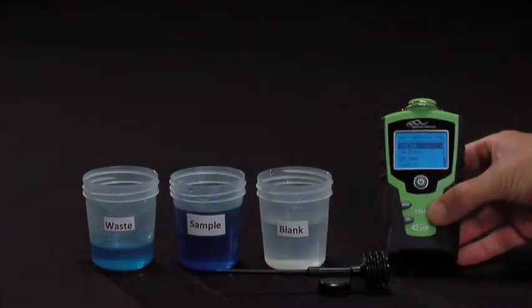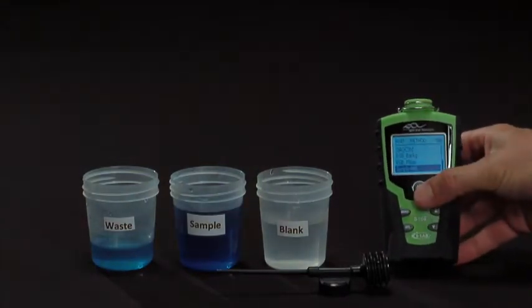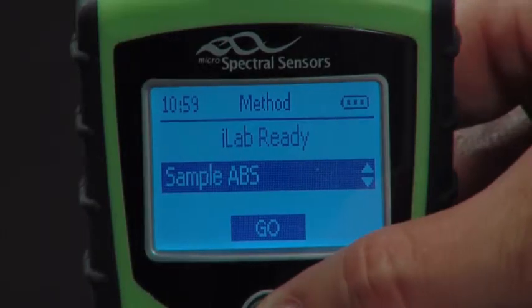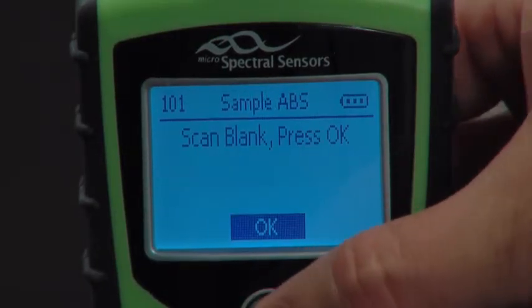We'll then scroll down to the method that we want to run, which in this case is sample ABS. We'll then press the center button to select the method and press the center button once more to start the method.